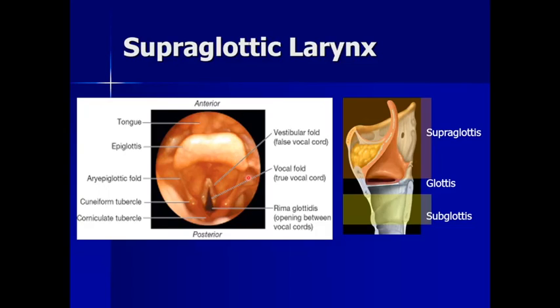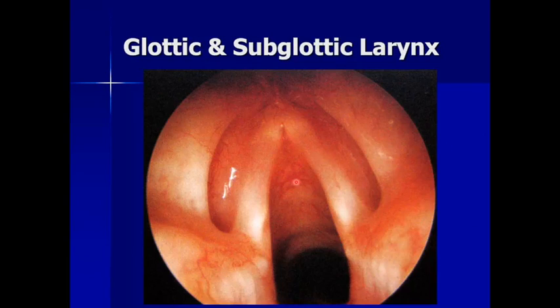So the supraglottic larynx is made of the dorsal surface of the epiglottis, or the laryngeal surface, as well as the aryepiglottic folds. There are two, the paired false vocal folds and the paired upper half of the laryngeal ventricle. As you advance the scope, you can see better the false vocal folds. You can see the laryngeal ventricle mucosa. It's beautiful. And here in the glottic larynx, you can see the true cords as they come together to the anterior commissure. Posterior commissure is not included on this picture, but notice you can see the mucosa of the glottic larynx, subglottic larynx, and even the trachea. So really the clinician doesn't need us for the mucosal disease, they need us for deep extension, the things that they can't see.